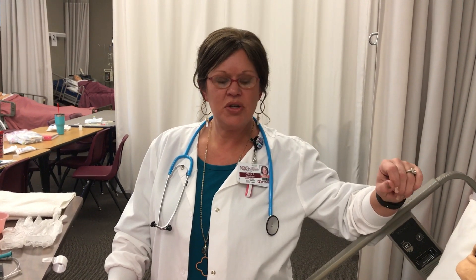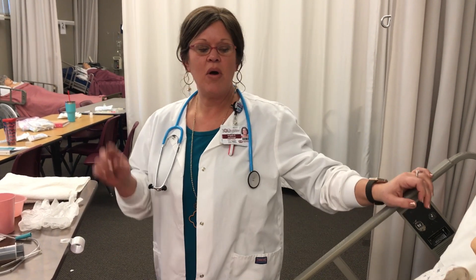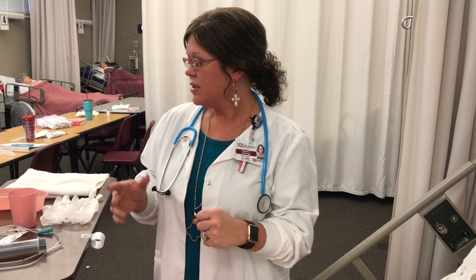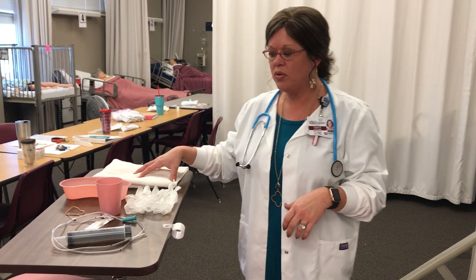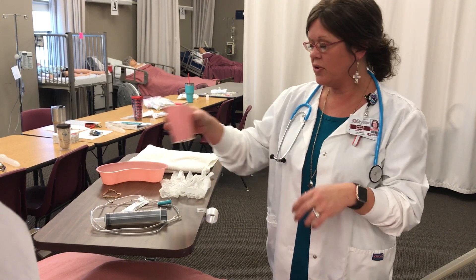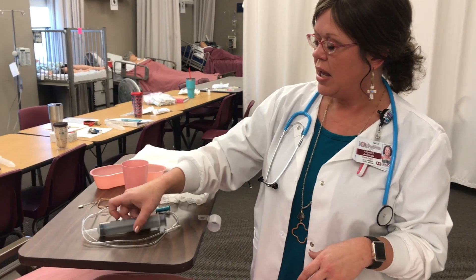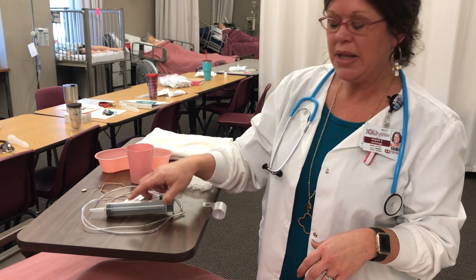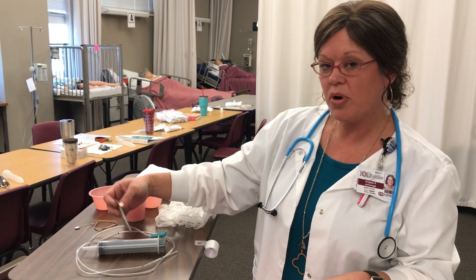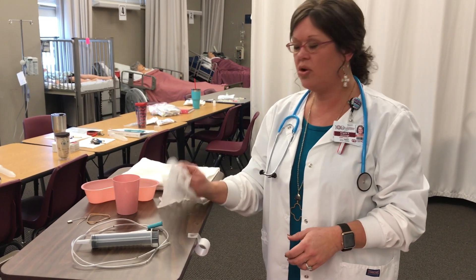We are inserting an NG tube into our patient. The first thing I would have done is checked my physician's order. Then I'm going to gather all my necessary supplies. If I'm inserting an NG, I always want to bring a towel, a little basin, a small cup of ice for the client, a rubber band and safety pin to secure it at the end, a syringe to check placement, the NG tube, lubricant, tape to secure it, and gloves.